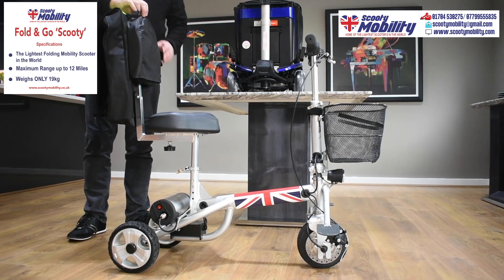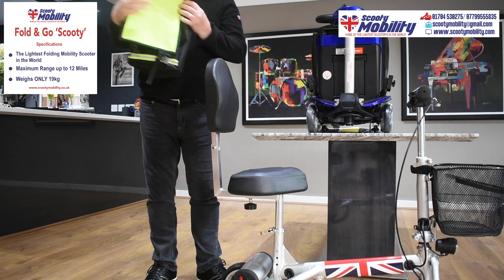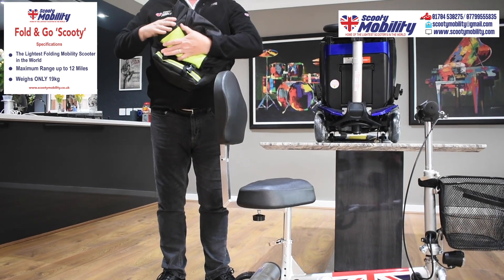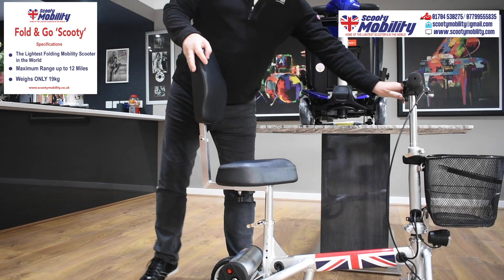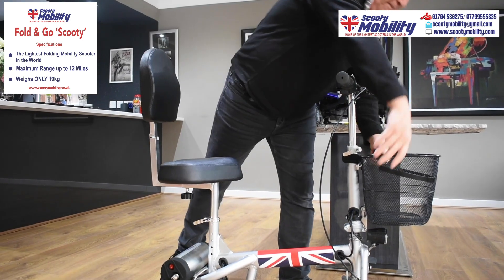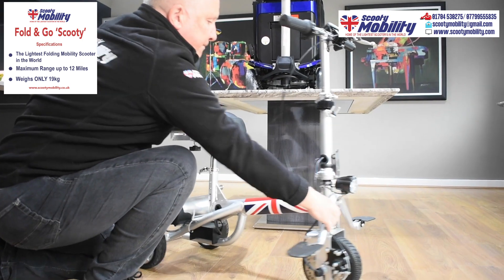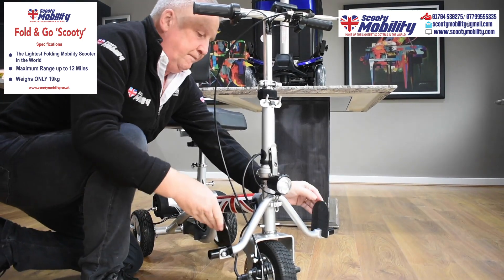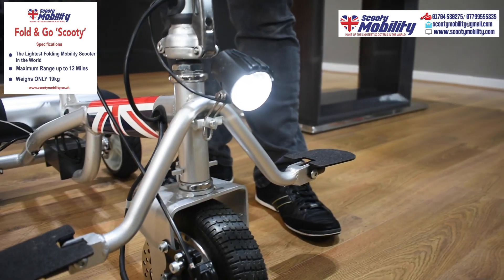So here is the scooter. I'm going to remove the bag that's included with it — the bag just clips on the back of the seat, a nice deep pocketed bag with a zip on it. There's also a mesh basket, obviously very lightweight. At the bottom here is where you'd put your feet, and they fold away too. The headlights light up the path in front of you.